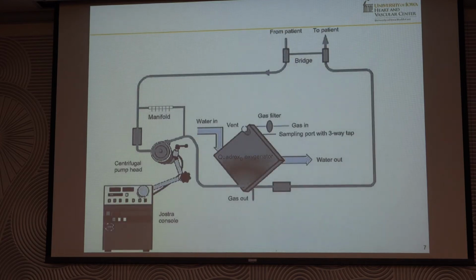So here's the basic schematic of the circuit that we use. Many of you probably recognize this. This is our rotoflow pump. Pretty common. It was designed or developed for cardiopulmonary bypass in the OR, and then we have adapted it to use at the bedside. That's pretty much every ECMO application. All of it is designed for the OR. So most of these therapies are only approved for 6 hours of use, but then we use it off-label for days, weeks, months, in some cases years, to bridge this patient to either recovery, to another device, or to transplant.